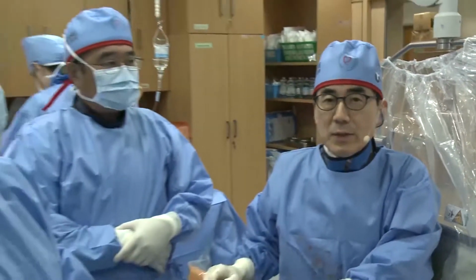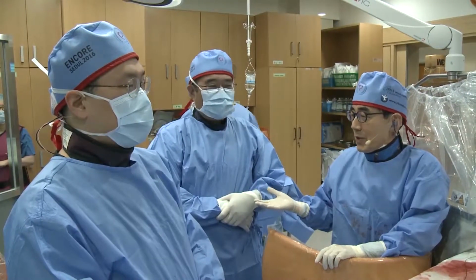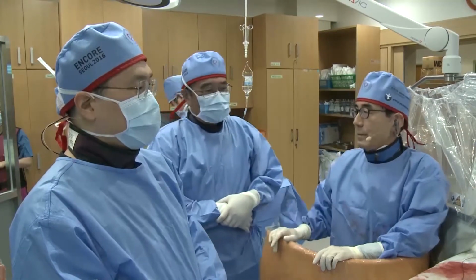We prepared a very difficult CTO case. For this case, we invited really eminent experts in CTO intervention. Dr., please explain your institute and name.